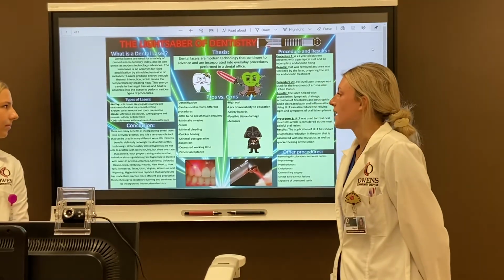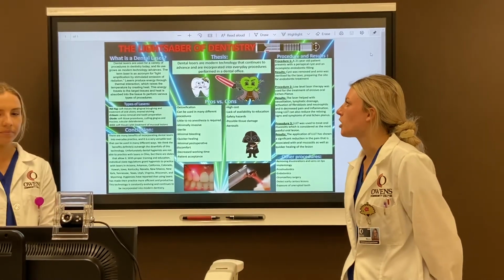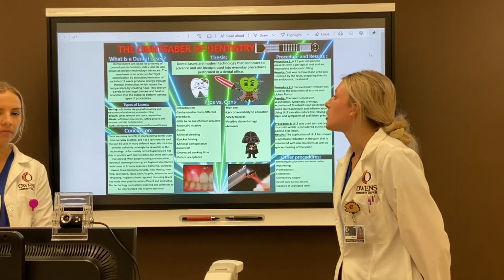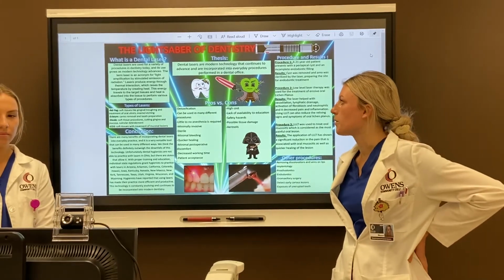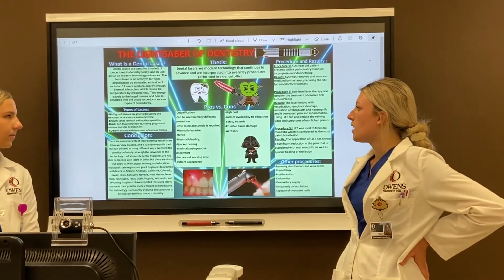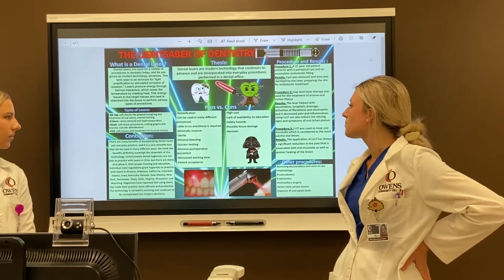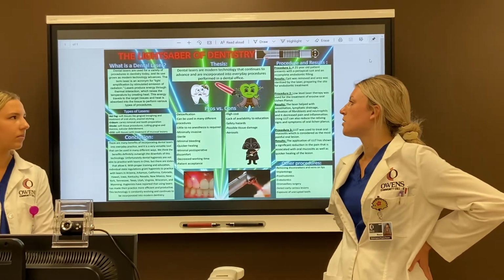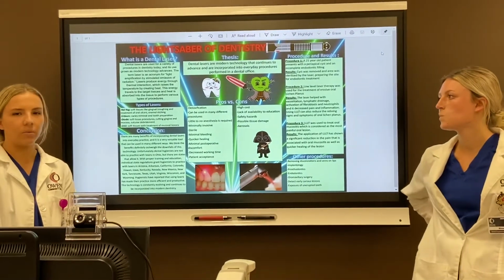There's the ND-YAG, which penetrates soft tissues and performs procedures like gingival troughing and treats oral ulcers. Then there's the erbium, which is used mostly for caries removal and tooth preparation for restorations. There's a diode, used on soft tissues, mostly in cutting gingiva and mucosa and for sulcular debridement. And there's a CO2, which is also used for soft tissues, and it's mostly used in the treatment of mucosal lesions.